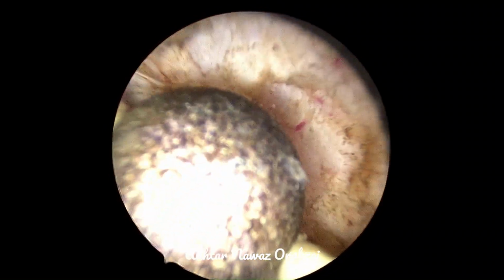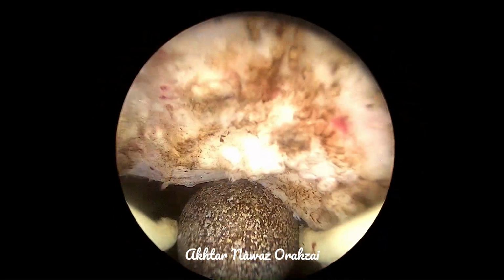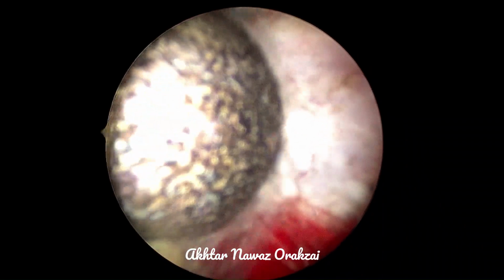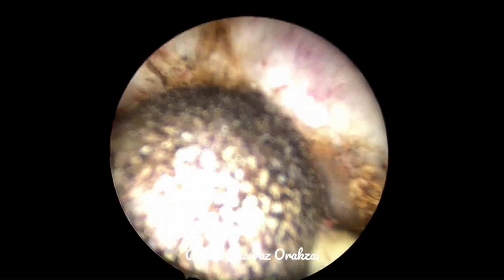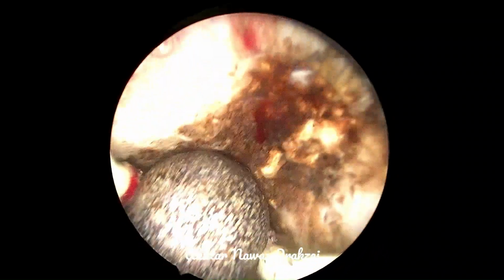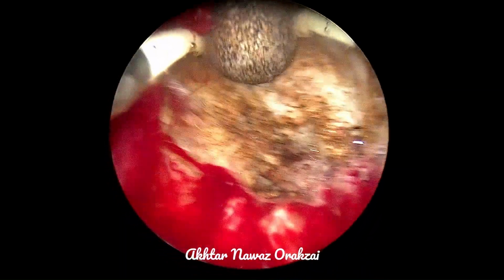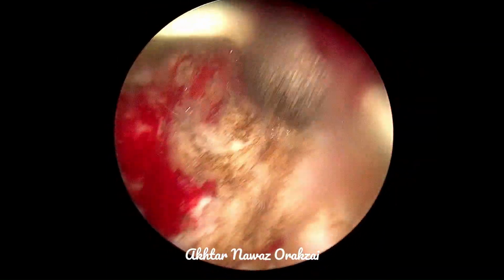The channel is made, as I mentioned earlier. If the particulars of the patient were not the ones that we discussed, if he was a patient who was not sexually active and his age was 65 plus, 70 plus, when the only important thing would have been avoiding incontinence, I would have flattened the bladder neck and I would have resected more of the prostate.